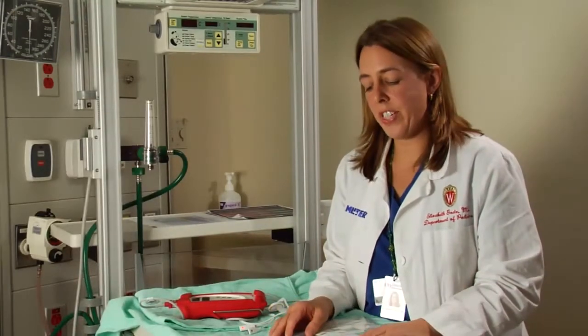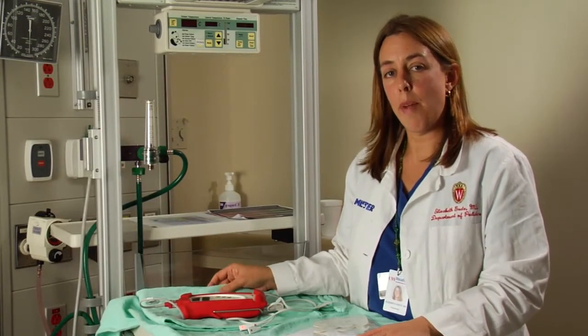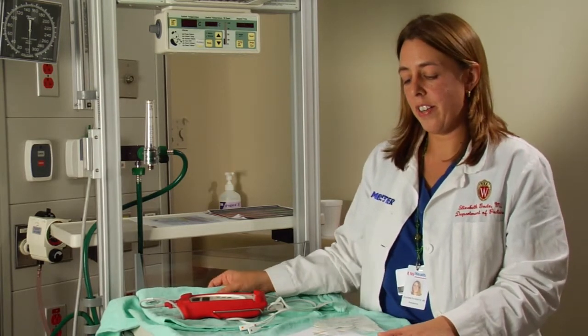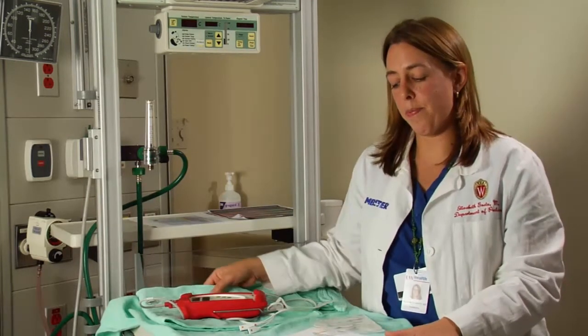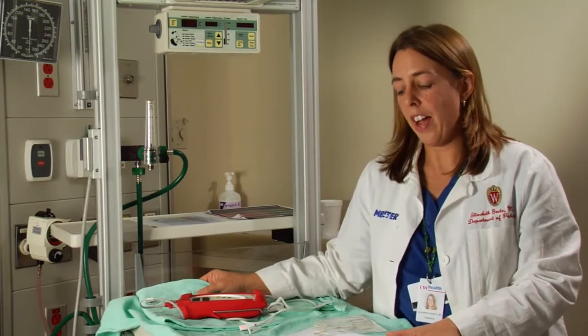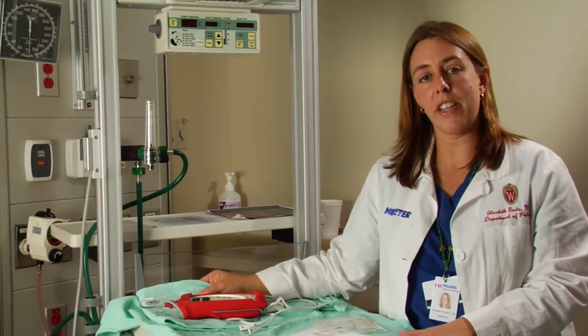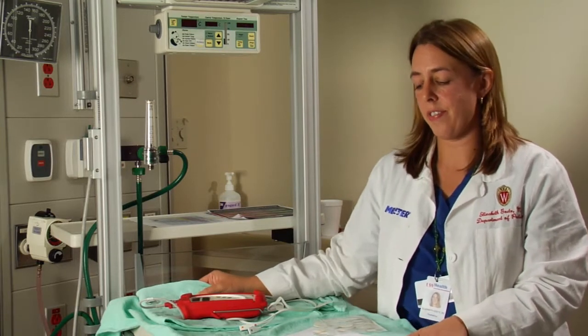Other things that are useful to have on hand are blankets for swaddling the baby. A parent or a nurse can be helpful to help soothe the baby during the screen. And it's good to have on hand a place to record the results of the pulse oximetry screening. Ultimately, the results need to be recorded on the newborn screening blood card, but different hospitals will have different places that they want to also record the results.